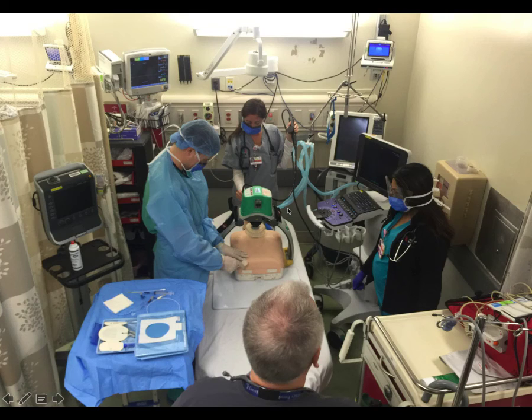like defibrillation or analyzing the rhythm, by, for example, trying to get to the place where you need to be with your machine, or blocking the view of the provider that is guiding the resuscitation and that is in charge of calling the rhythm.